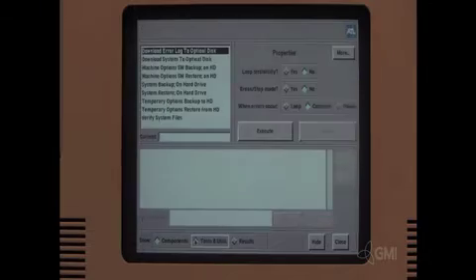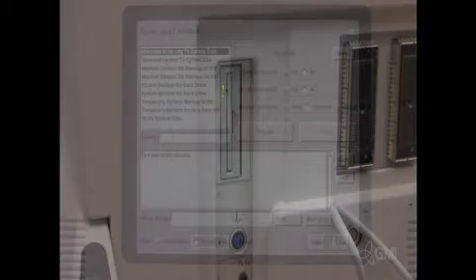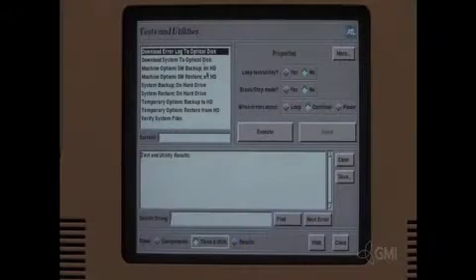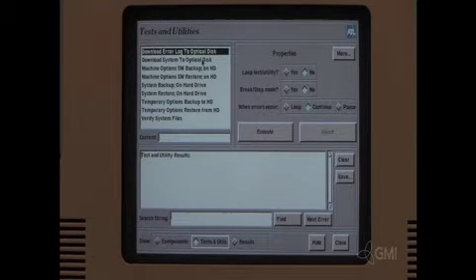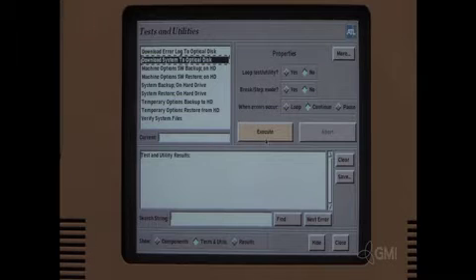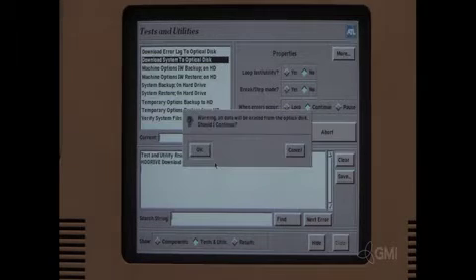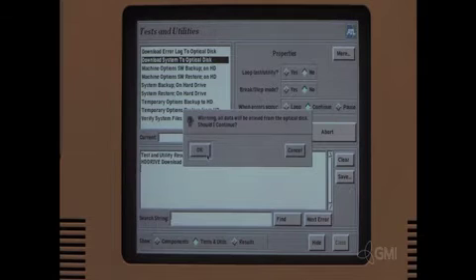Select HD drive. Select test and utilities. Insert a 540 megabyte optical disk. Select download system to optical disk. Select execute.